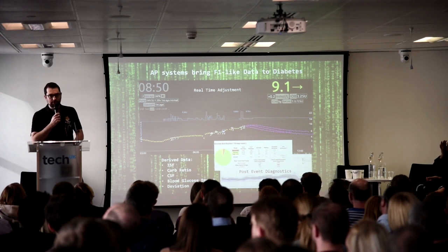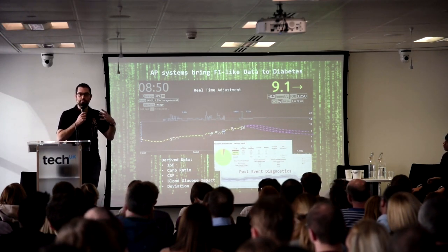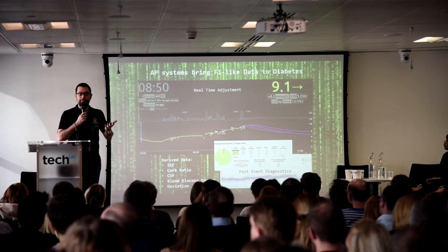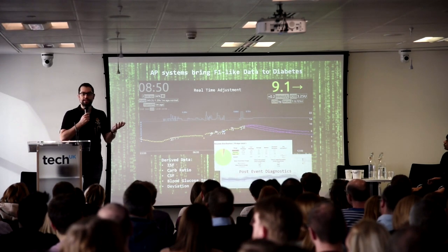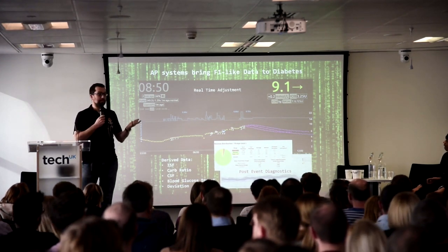It gives us the opportunity to do a bit of research, pulling big data and actually finding things out that, well, how many people in the room would know how their insulin sensitivity changes on an hour-by-hour basis through the day? People who've got loops, I see.